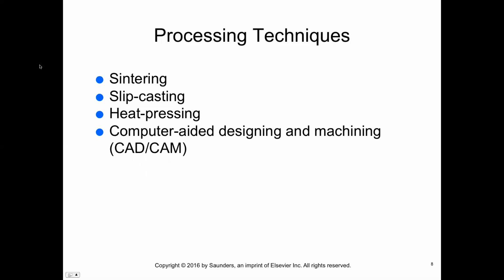Slip casting is a processing technique where the ceramic powder is mixed with a water-based liquid to form a mass or slip and pressed into a porous refractory die that soaks up much of the water. This mass is then fired at a high temperature to create a porous ceramic core. This core is infiltrated with molten glass by capillary action to make a dense, strong core where porcelain can be added to develop the desired color and degree of translucency or opacity.